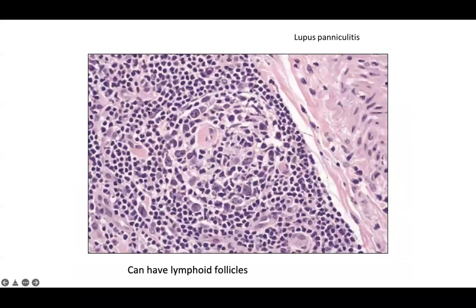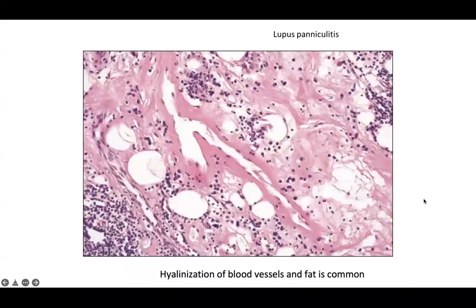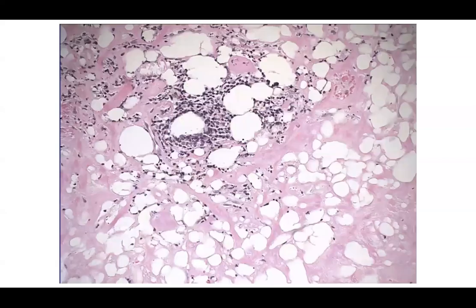Another example of lymphoid follicles trying to form within areas of lupus paniculitis. Many times you can see hyalinization of blood vessels and fat, as well as lipomembranous change, making it look very similar to lipodermatosclerosis. However, the clinical picture of lipodermatosclerosis is much different than the clinical picture of lupus paniculitis.